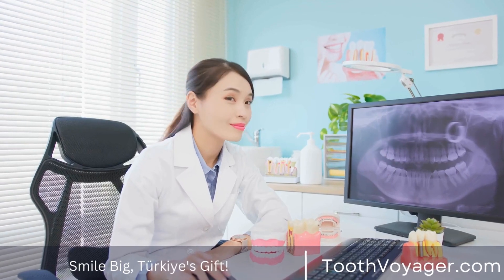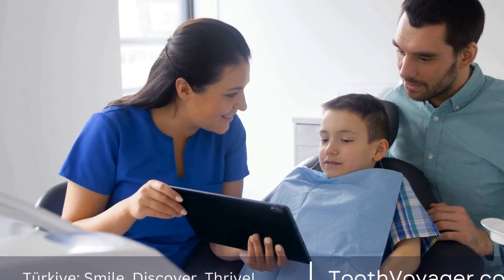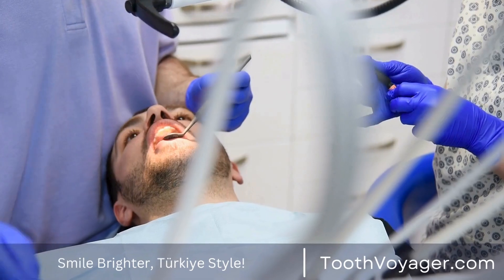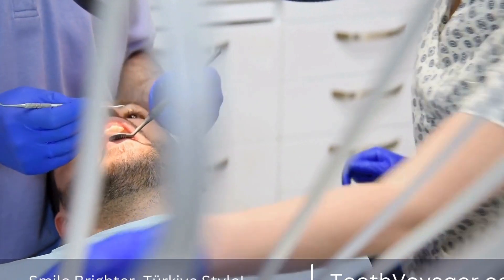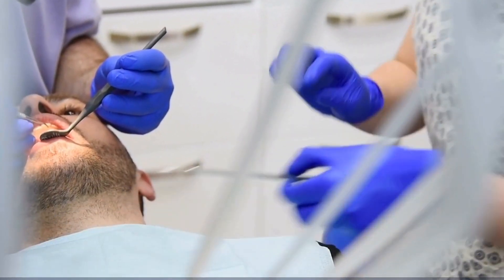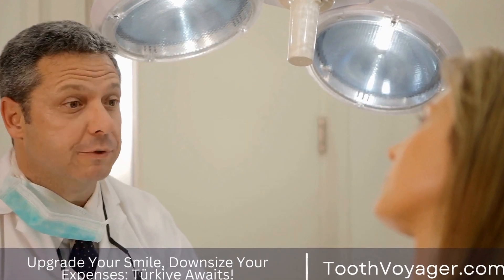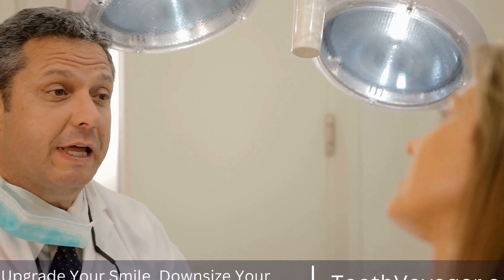Conclusion. Digital dentistry has significantly improved the way dental procedures are carried out and has enhanced the overall patient experience. From digital imaging and intraoral scanners to CAD-CAM technology and treatment planning software, these advancements have streamlined the diagnostic process, improved treatment outcomes, and increased patient satisfaction. As technology continues to advance, we can expect even more innovations in digital dentistry that will further revolutionize the field.